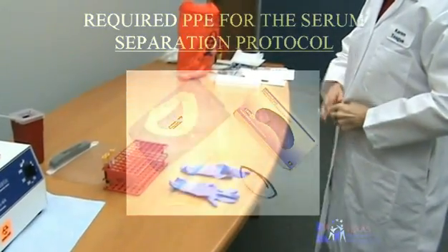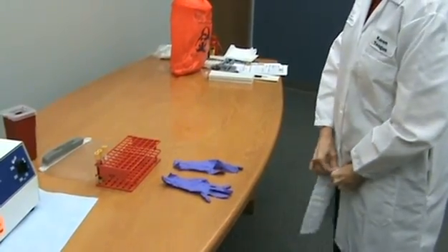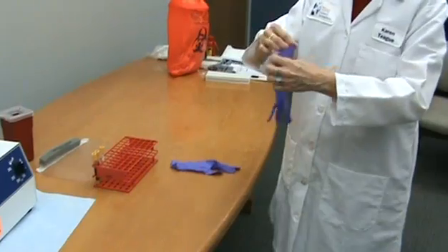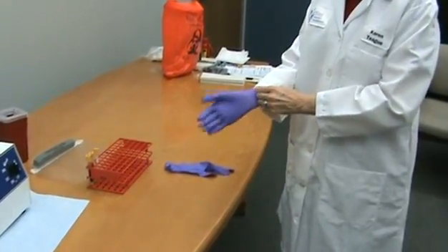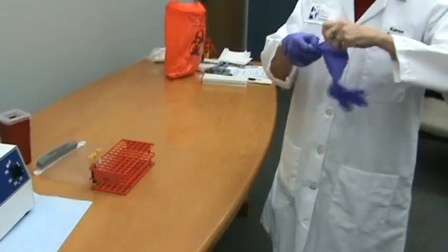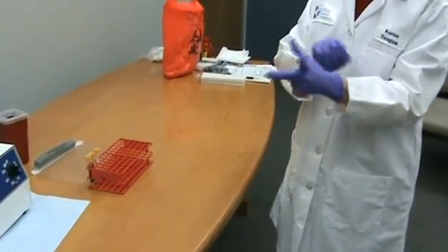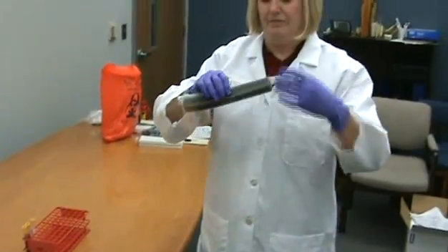When working with blood specimens, appropriate personal protective equipment or PPE must be used for personal safety. The recommended PPE for separating serum from red top or serum separator blood tubes includes gloves, a lab coat, and face protection as appropriate for potential splash hazards. Face protection could consist of a face shield or safety glasses.